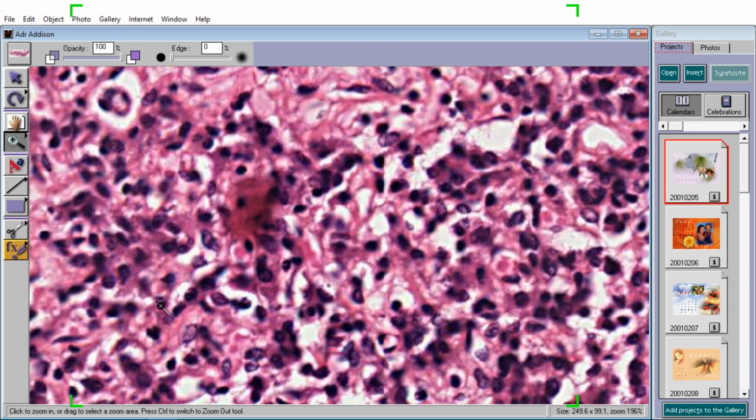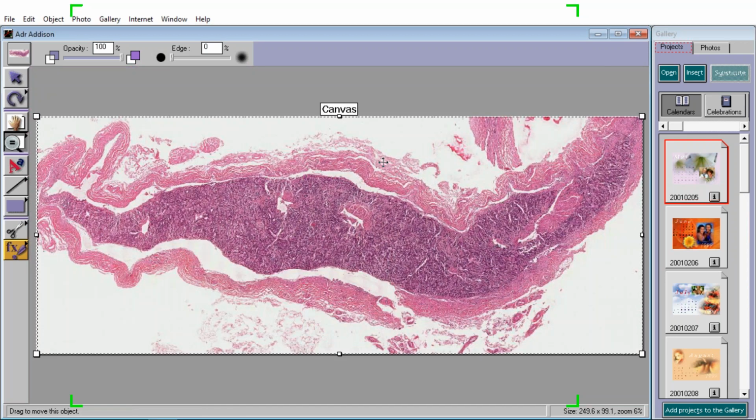So why would you have an infiltration of lymphocytes within the adrenal cortex? It's something that we talked about. Maybe these lymphocytes are reacting against its own adrenal cortical cells. And that would be a classical example of an autoimmune disease. Remember, we had a big list of autoimmune diseases, and we said that just about any tissue in the body, if it is being attacked or not recognized or not tolerated by its immune system, can result in a chronic inflammatory reaction.